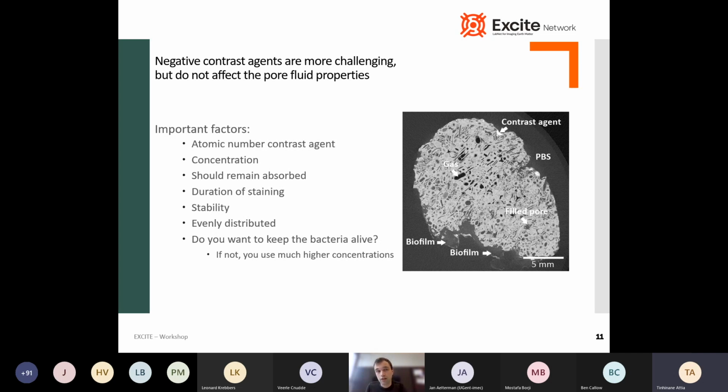So, these contrast agents can work, and this is an example of a stone where a biofilm was grown on, which was stained and then submerged in a salt-rich solution. A salt-rich solution is a physiological solution, which is PBS. And as you can see, there is an extra phase visible. You can distinguish the biofilm from the physiological solution, but the contrast agent I used is not ideal because it's not evenly distributed. You can see here, if you see my cursor, that there are zones in the biofilm where there's higher attenuation because contrast agent was precipitated.